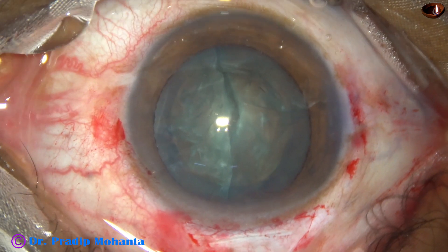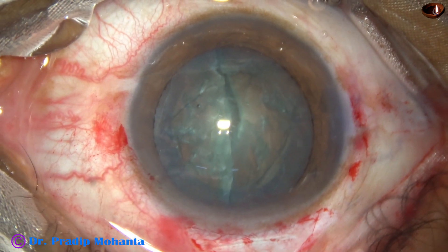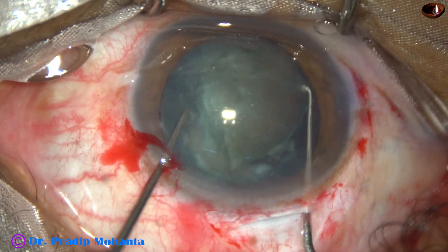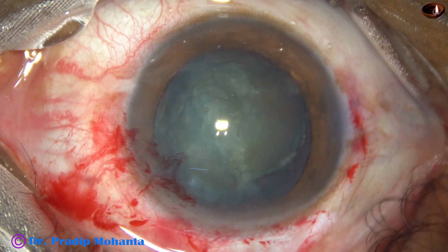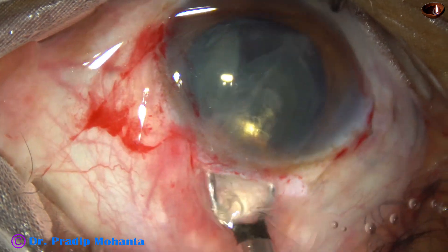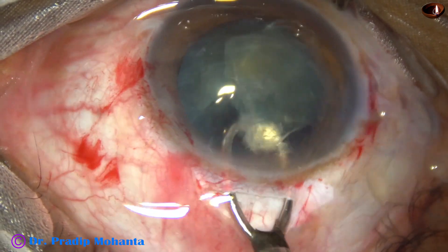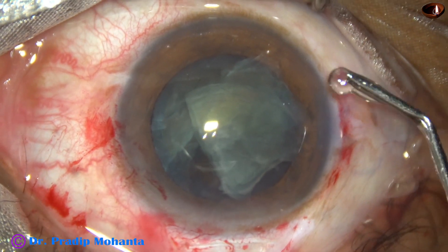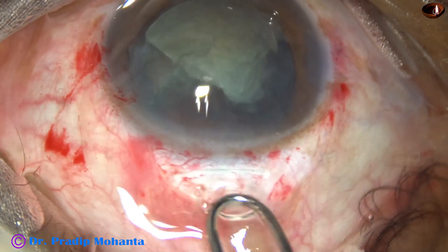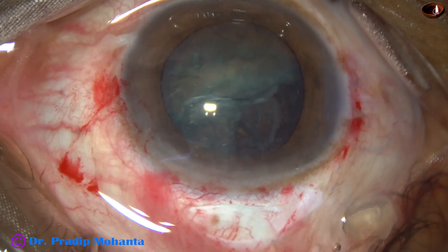Now I have to pull these hemi-nuclei out of the bag. Since the size of the rhexis is small, it will not come out easily. So I use two hooks and bring one hemi-nucleus out. With the help of an irrigating vectis, I try to remove one hemi-nucleus, but it breaks in the tunnel. Now I inject visco through the side port as well as through the main wound, and try again with the irrigating vectis. This time this portion of the nucleus comes out.